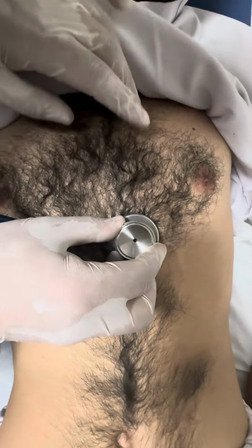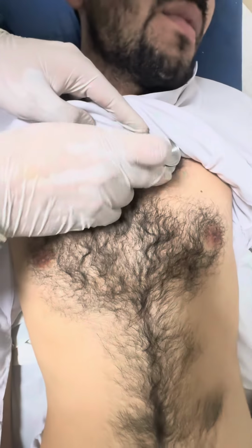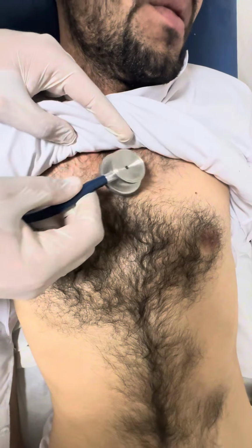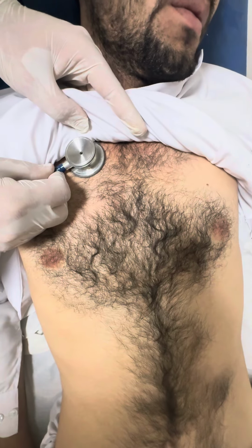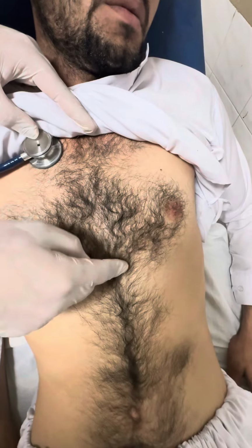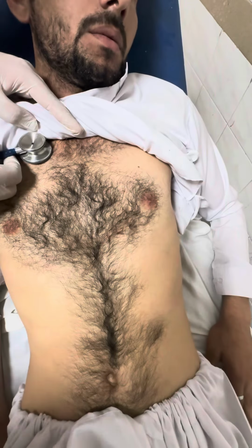It lies in the fourth intercostal space, while the mitral area lies in the fifth intercostal space. Now we will auscultate the pulmonary area. At the end, we will auscultate the aortic area for the murmur. Aortic area lies in the second intercostal space.